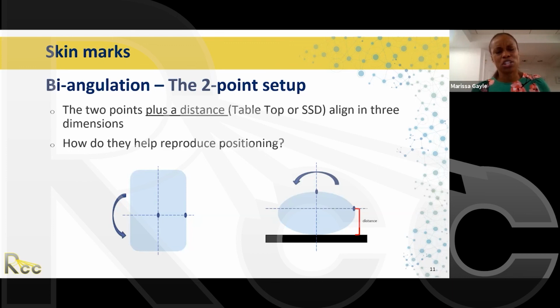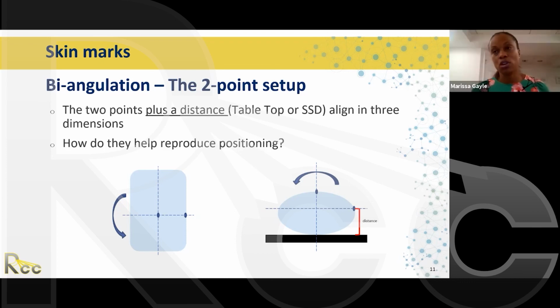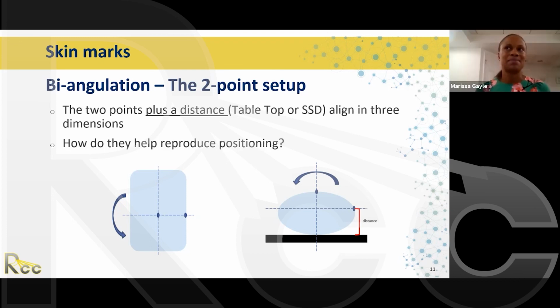And the second part was the question, how do we keep imaging to a minimum? So they offer MV images every day. So how do you avoid irradiating the arms unnecessarily? I don't know if you can avoid it. You can probably bring in the jaws, but depending on where you're treating, you may not get the area that you're treating. Let's say their arms are at their side and you have a spine: you can bring up the blades to cut out the arms, but you won't see the spine. So you may have to go through the arms.